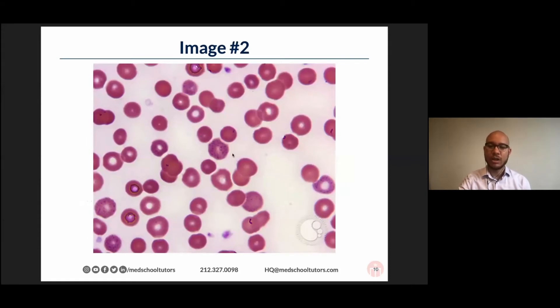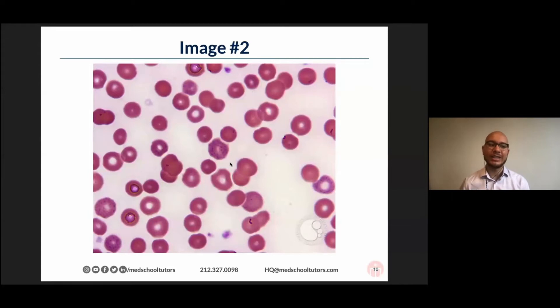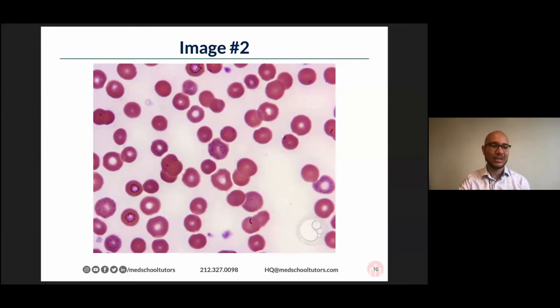I want you all to focus in on this blood cell here that has a speckled pattern to it overlying it. I'm already seeing one correct answer, and so this is the point where you all should go ahead and put it in the chat.